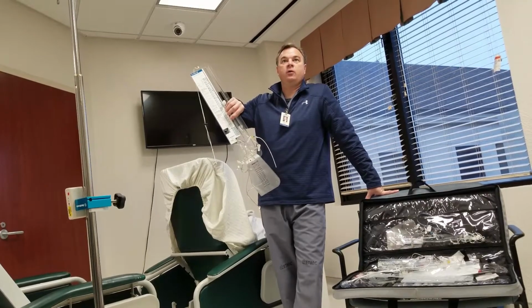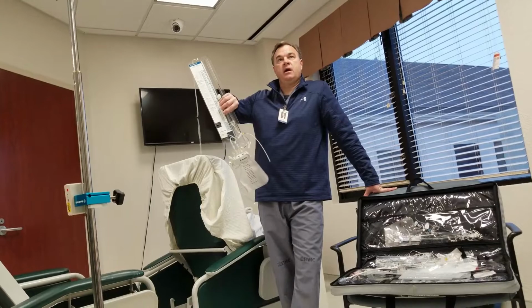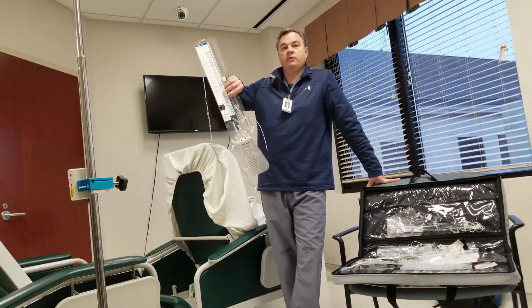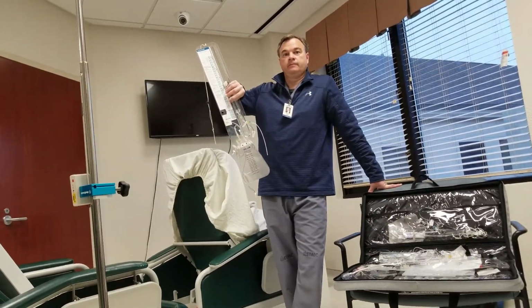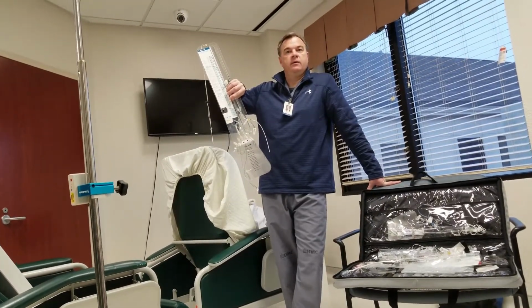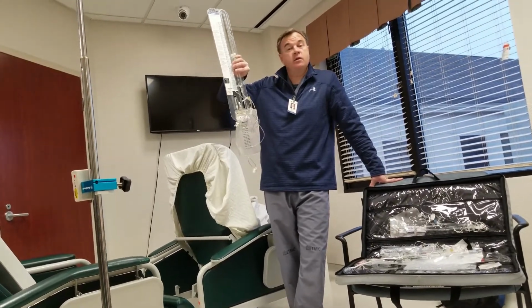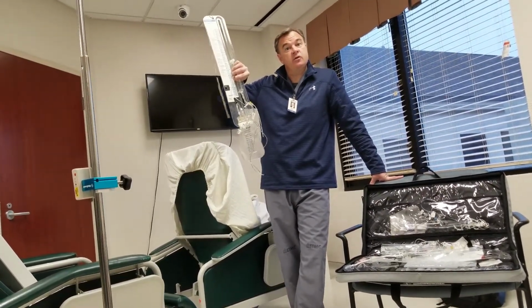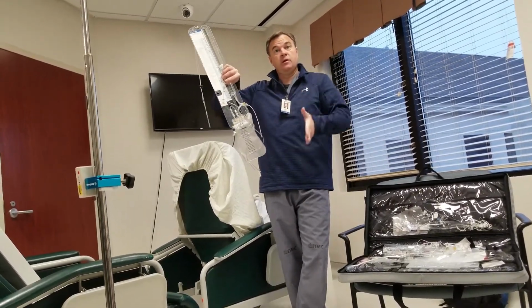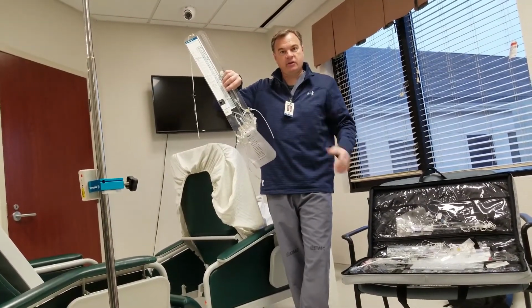I thought he was going to write the orders at 8 centimeters of water pressure. Yes, it was, and if it's over 30 mLs, then he or Dr. Pelosa would get a call. 30 ml in 4 hours? Usually a 4-hour period, yeah. But again, we're more worried about pressure. As long as you're still up here, you really can't get yourself into trouble, because your pressure is just slightly below normal. So you're just weaning off and taking pressure off that patch.